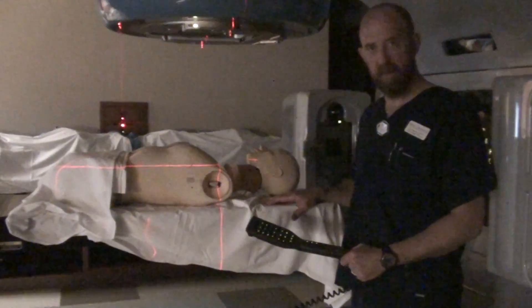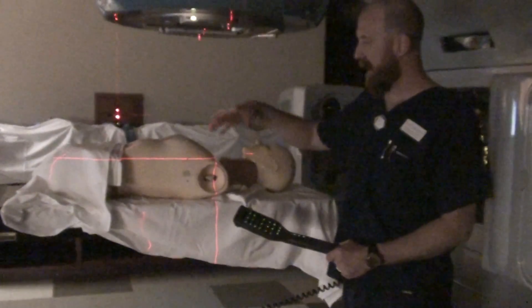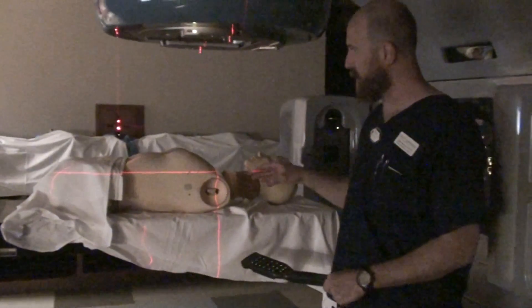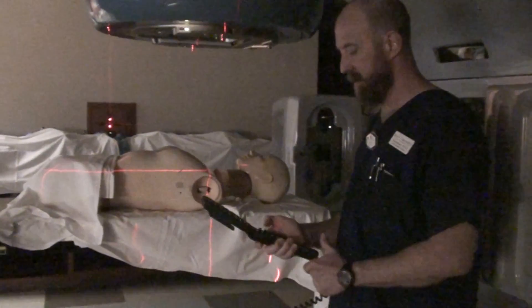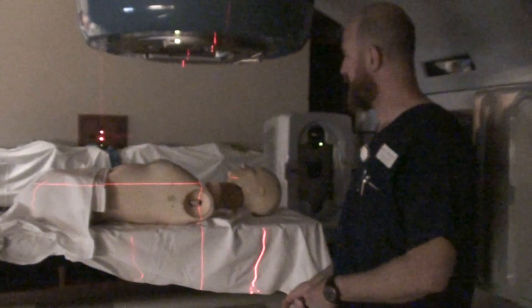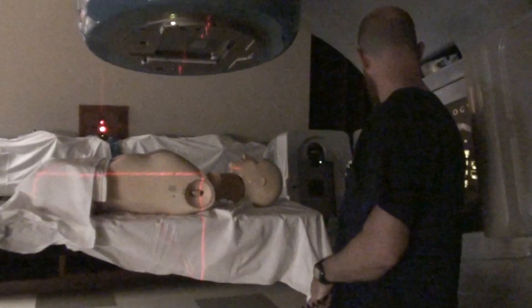For a three-field breast treatment, you're going to have two tangents and a supraclavicular. Normally the supraclavicular is either with the gantry at an anterior 0 or 180 depending on how your gantry is set up, or it can be 15 degrees off. I'm going to do 15 degrees off just for demonstration.